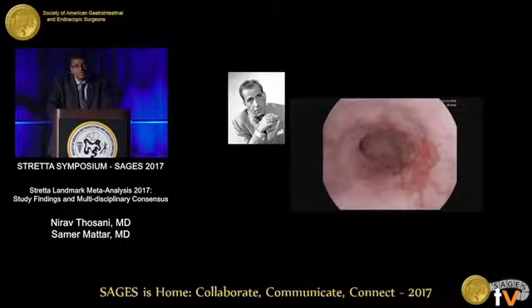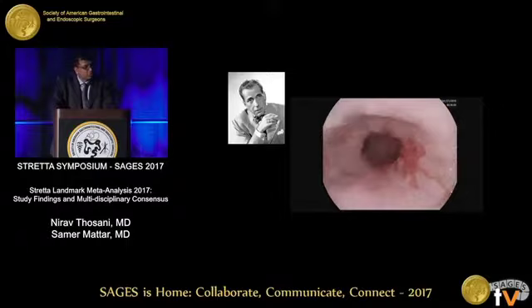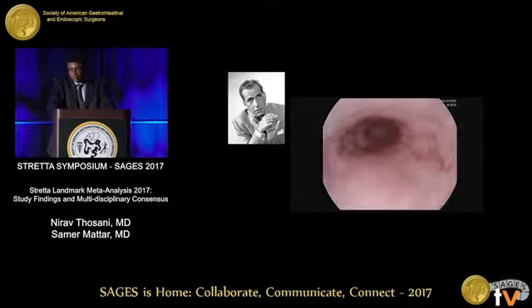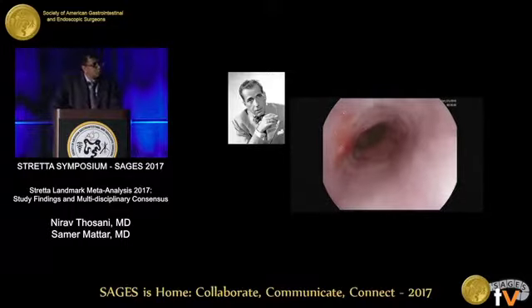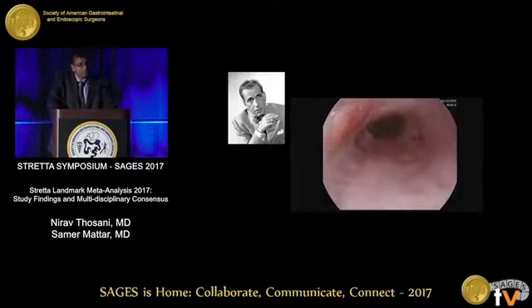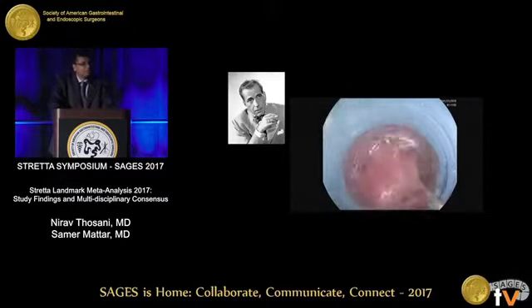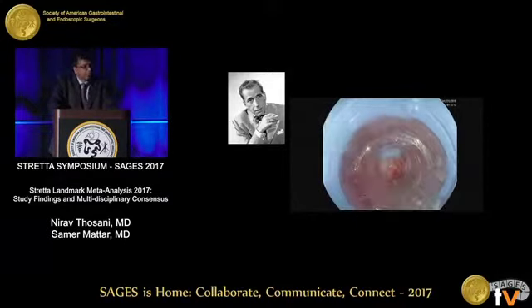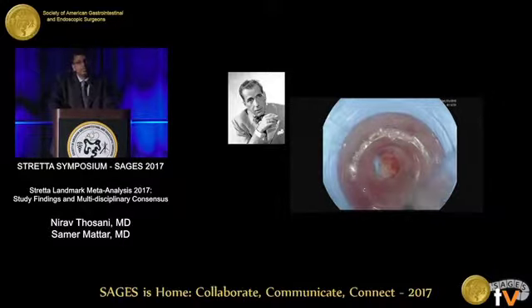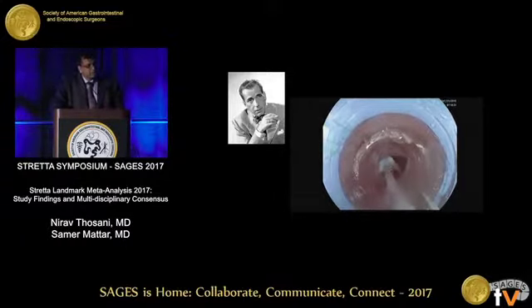And finally, if this gentleman comes to your office and you do endoscopy, you actually find a complication of reflux, such as here you see Barrett's. Also, you see this small early esophageal adenocarcinoma, which you can treat endoscopically and fix. This is actually one of our patients where we found esophageal cancer, we treated it, and we treated Barrett's by application of radiofrequency energy, but then comes a big question: are we going to stop now, or fix the real problem which started all these things?